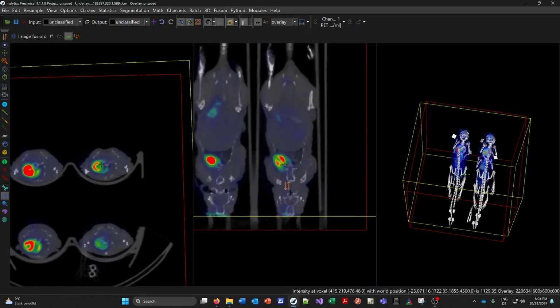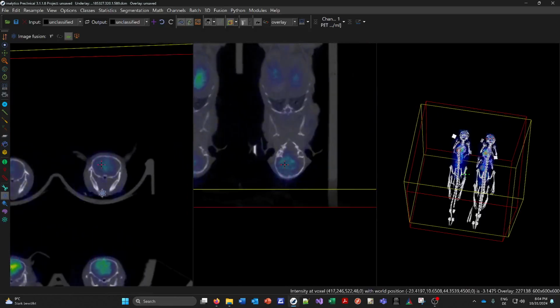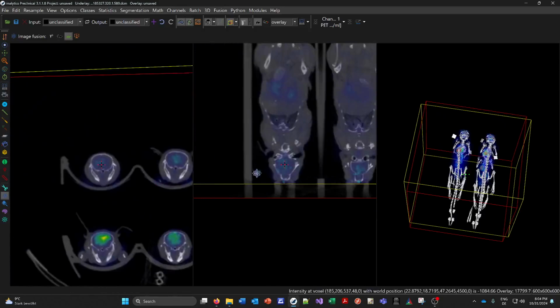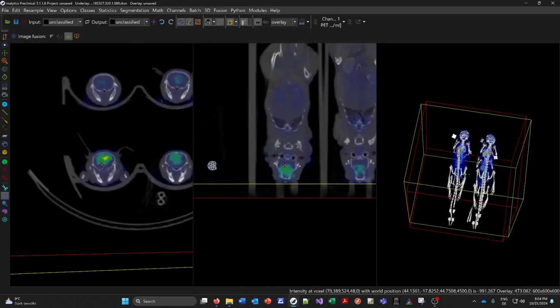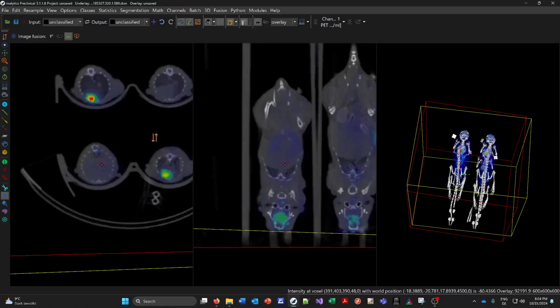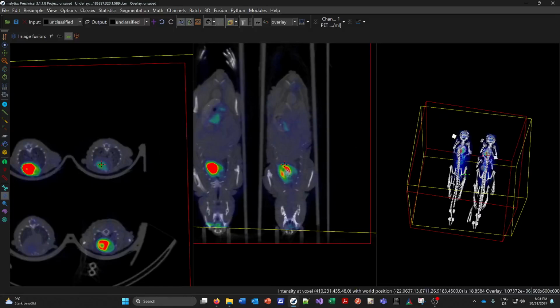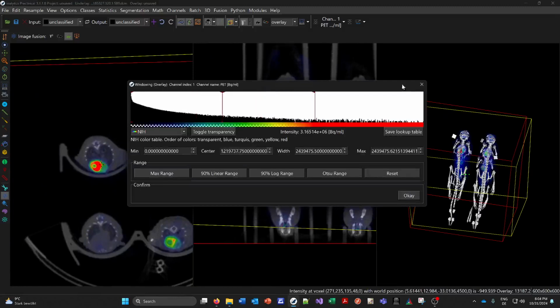And let's also have a look at the brain here. So let's try to get the 4 brains into position. Maybe a bit back here. And let's look at the hearts. Maybe change the windowing a bit.